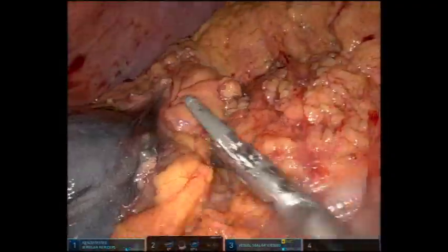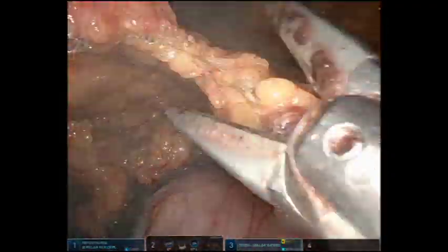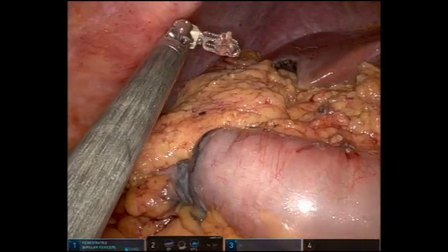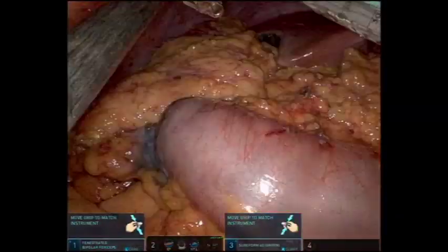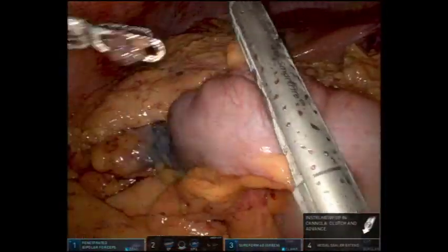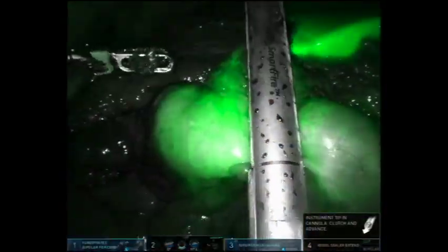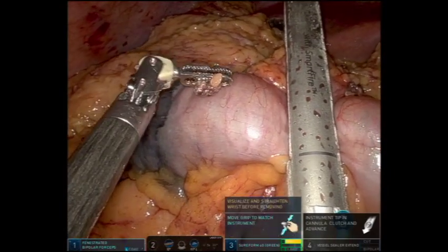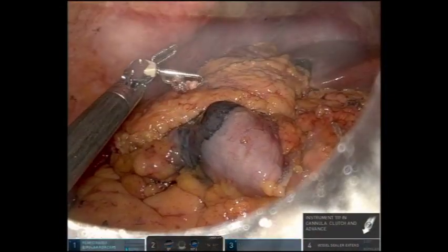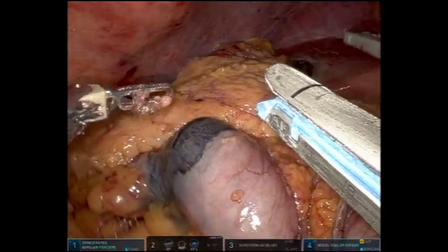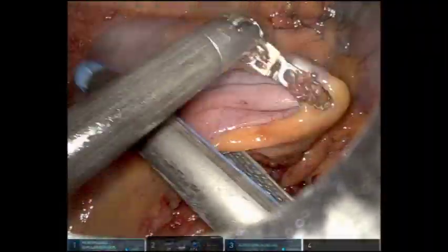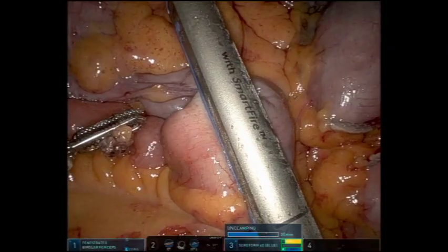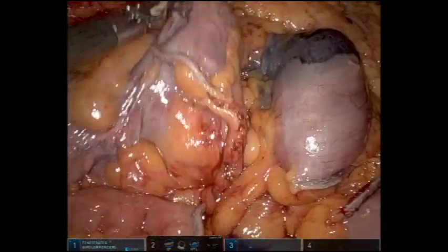A small omental band is taken down to complete the dissection. The patient is injected with four milliliters of indocyanine green. Well-vascularized transverse colon is then transected using the robotic stapler with a green cartridge. Once the transverse colon has been transected, a blue robotic cartridge is placed across the terminal ileum and the well-vascularized small bowel is transected using the stapler.